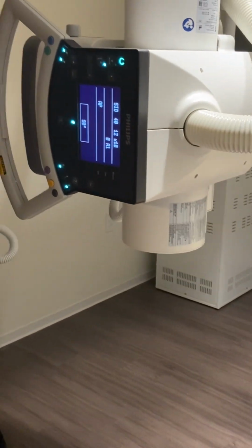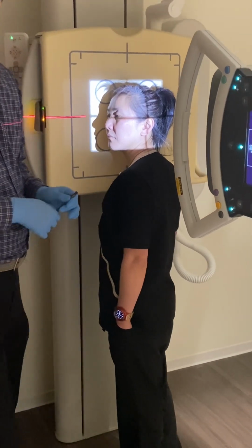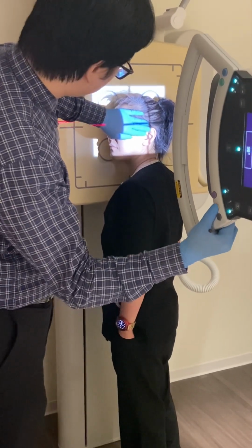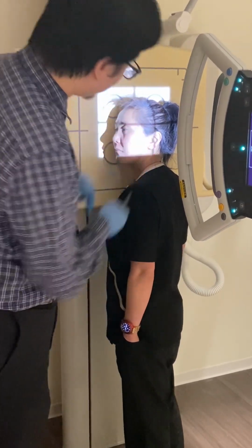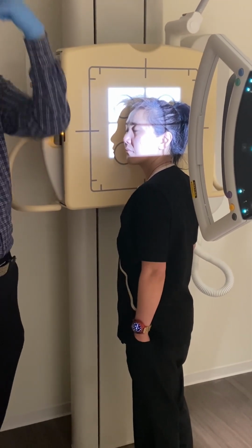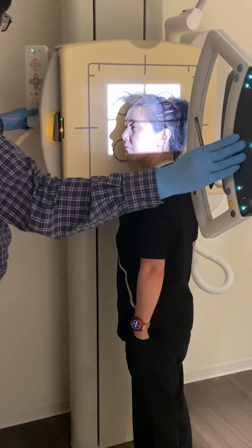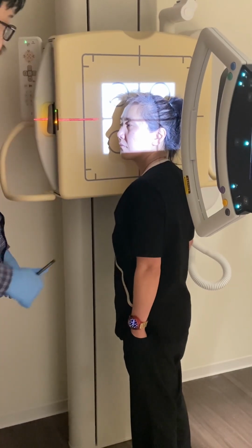Great. Notice that I'm putting our central ray here, right where the EAM is. And we're going to be centering 2 inches above the EAM. So we're going to be centering right around here, 2 inches above the EAM. Notice we have cut off the chin, but we are focusing on the skull, the cranium, the upper part. We don't care about the chin. All right, so careful, I'm going to raise this up slightly. Good, you can touch again.